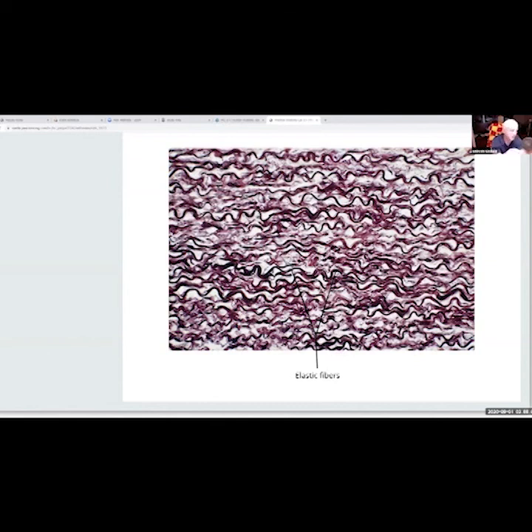It has to stretch. Perfect. Okay? It has to stretch. It has to be able to handle that force. Anybody hear of an aortic aneurysm? Aortic aneurysms are usually fatal. You bleed out instantly. I mean, you have minutes to live, if that long. Because if this ruptures, all the blood that's going to your body comes out of it. It has to stretch. That's why if you look at the histological slide, you see all kinds of elastic fibers.